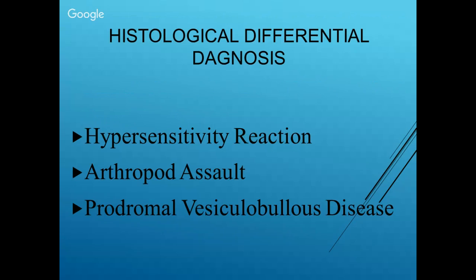What tells you that this is BP? The same pattern actually. So inflammation in the dermis with a lot of eosinophils, but the split is not there. But more commonly, what is the main differential diagnosis? Drug eruption, arthropod bite. Those are the two main. So drug or bug, that's how they call it actually. It's either drug or bug. But one other differential diagnosis that many people tend to forget is an urticarial phase of bullous pemphigoid, and that can actually present just like a drug reaction actually. So you'll have the perivascular inflammation with a lot of eosinophils. If the patient is old, you have to at least think that maybe this is BP, and the immunofluorescence might help the clinician actually.